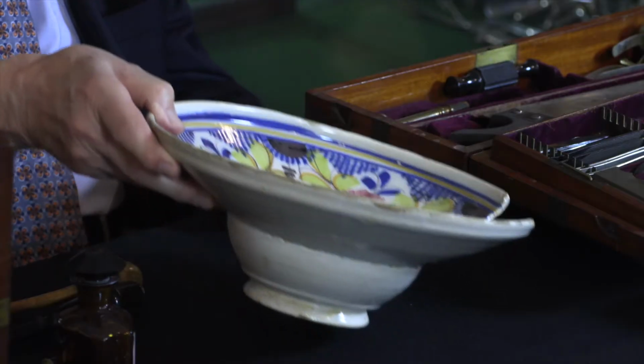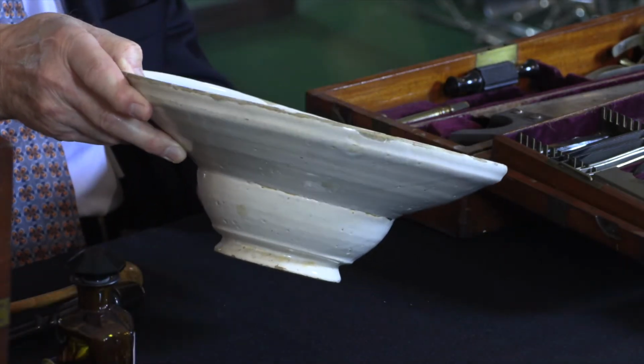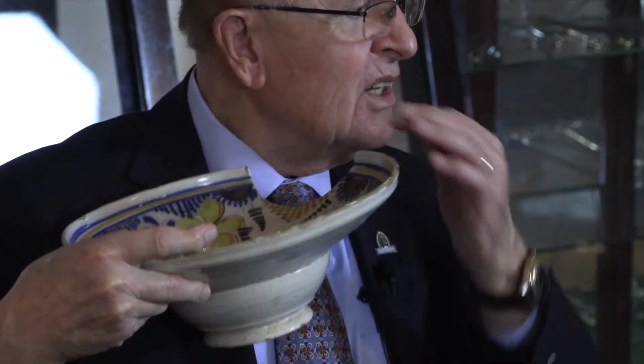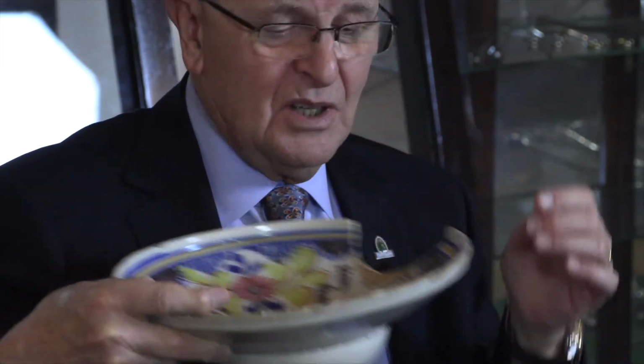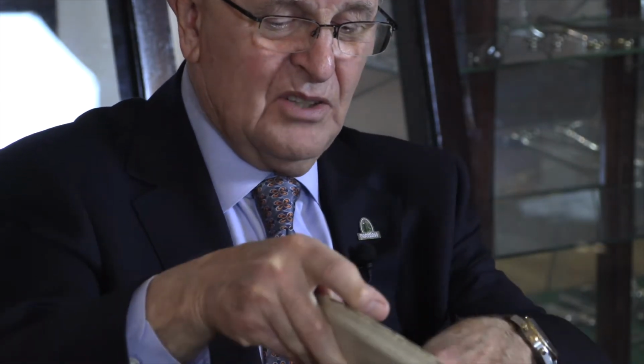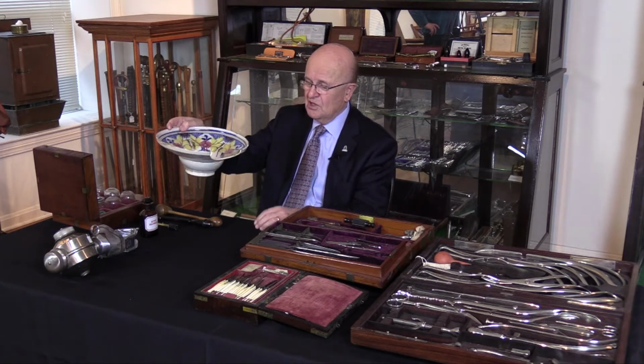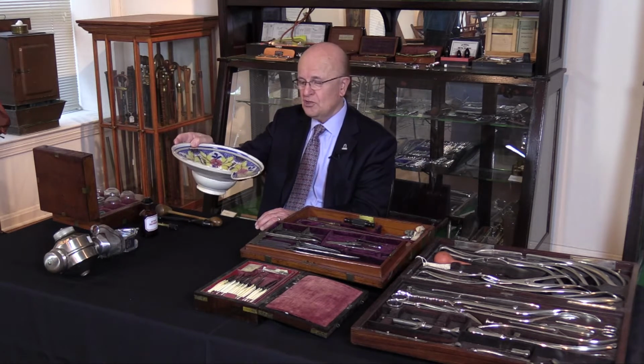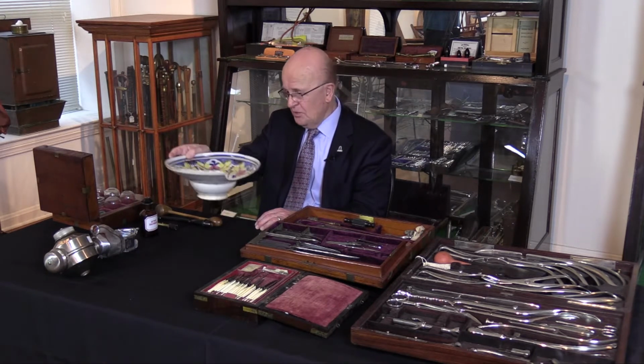And this was the oldest way of doing it, is to put this against this area here against the neck, make an incision and get the blood to run and be collected in the deep part of this. As a matter of fact, you could find this in some of the barbers' stores that they did this job.